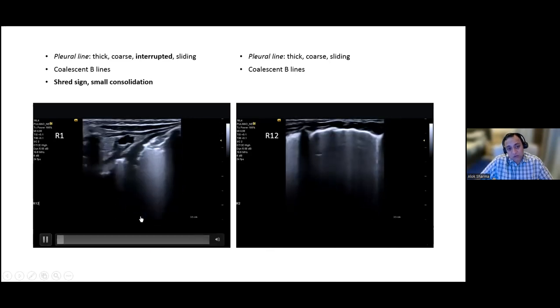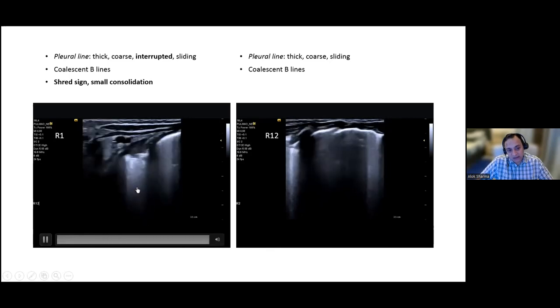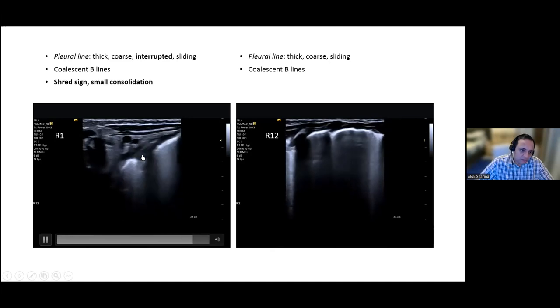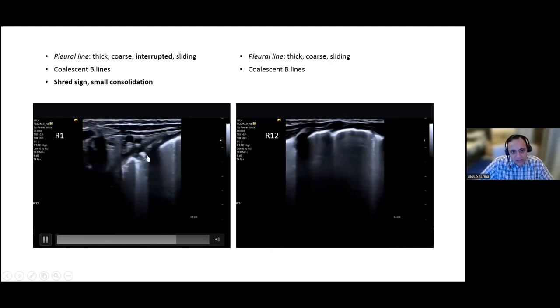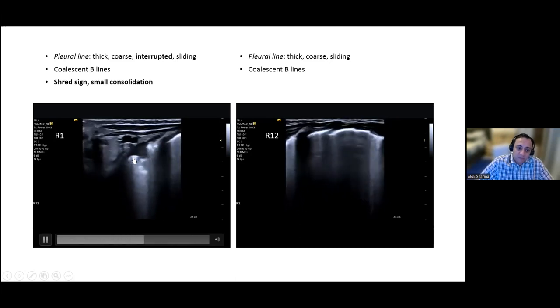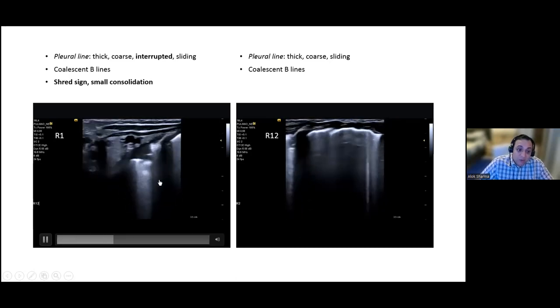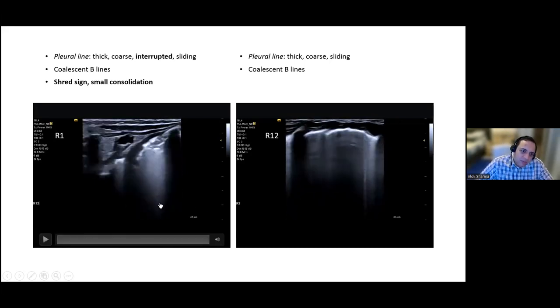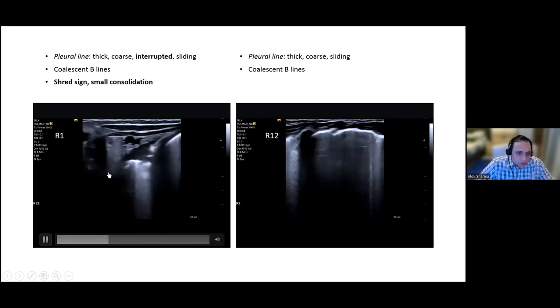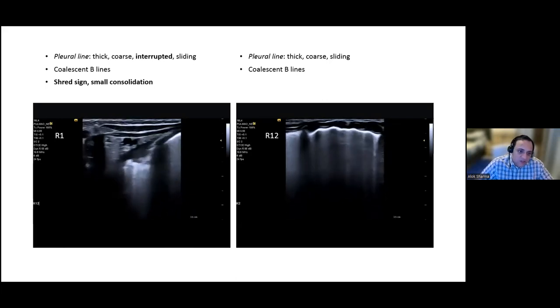I think what you've got is thymus coming in, and that hypoechoic area around the thymus is actually fluid in the thymic capsule. It's not a pleural effusion. Below that, you've got the right upper lobe, and you definitely have pleura established lower down, but then you've got a very regular area that could be a subpleural consolidation, quite an extensive one, and a possible shred sign that looks very regular. You lose a little bit of pleural line at the top, just there. The question is whether it's associated with a little bit of atelectasis. But I would be very suspicious of whether that's a shred sign.